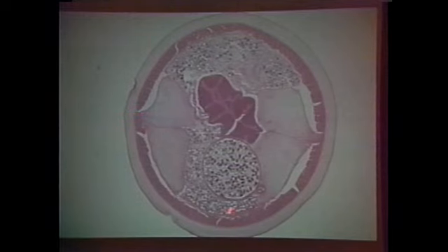Now, let's talk about lateral cords. Lateral cords are found laterally. That's very good. And these are they, right here. This is the lateral area. You say, how do you know it is? It's because there is a ventral nerve cord here. But anyway, there is hypodermis.